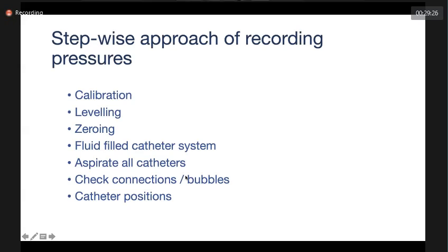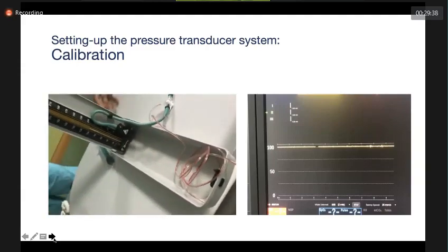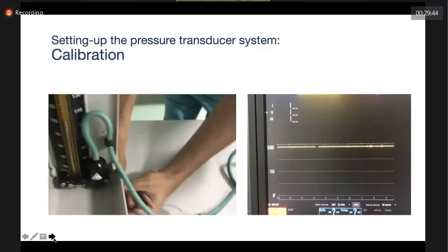Aspirate all catheters, check connectors, bubbles, catheter positions. This is going to be your today's lecture to some extent, the first half. How to calibrate a transducer system. Most of the people, they are not doing it, believe me, they are just checking the transducer, just recording it.